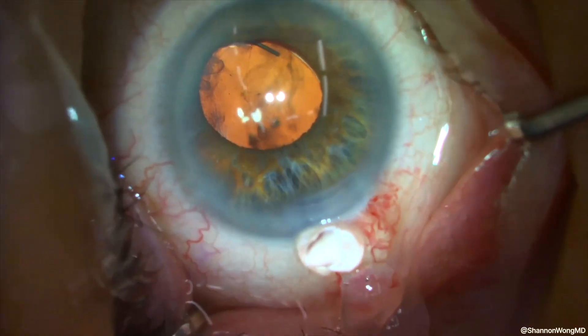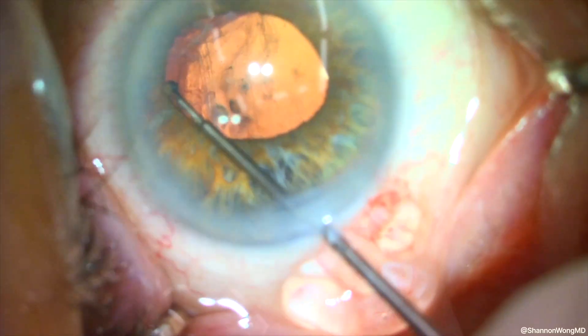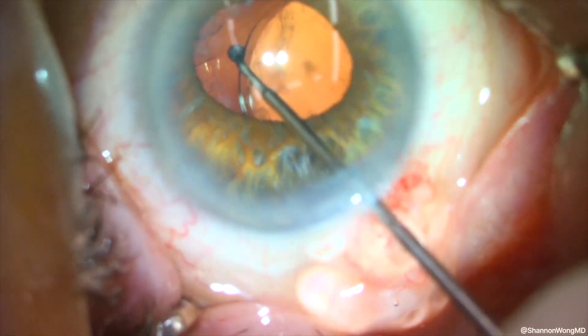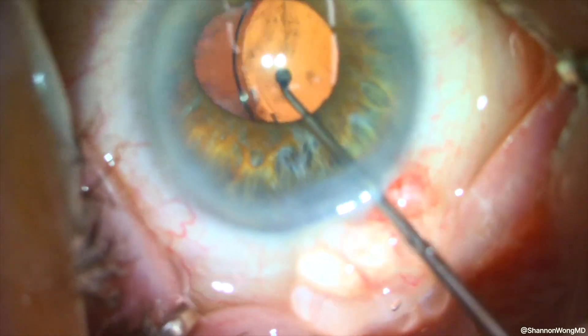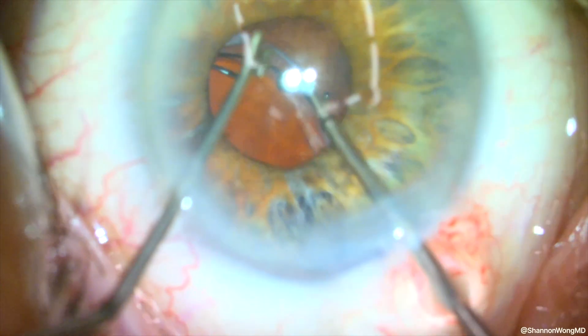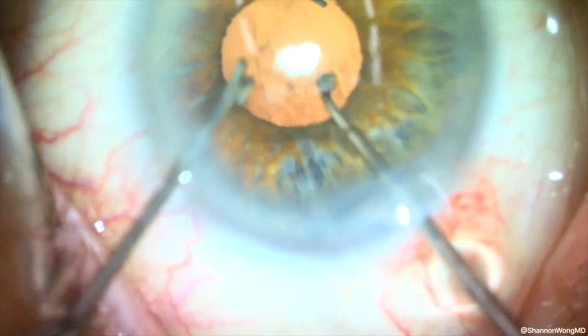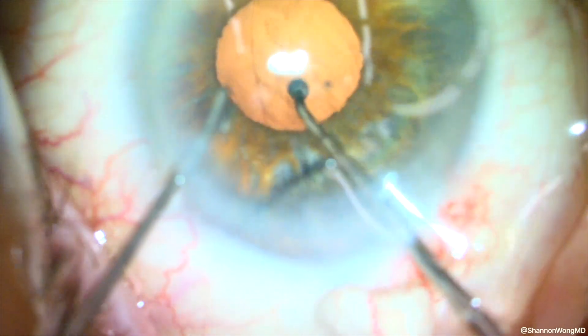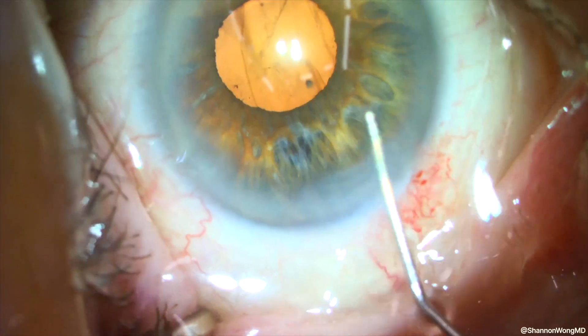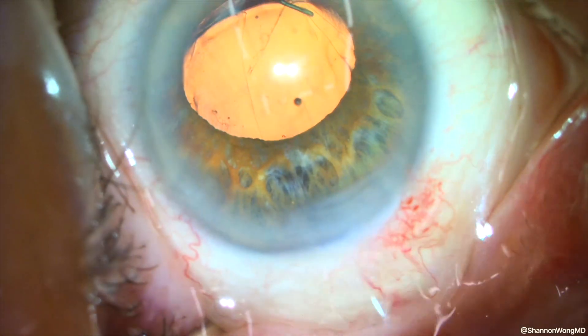What I notice is that the optic is not centered. We gently maneuver the left half of the lens optic posterior to the anterior capsular leaflet, then move the right half of the optic completely behind the anterior capsule for optic capture. We then viscodilate the pupil to inspect the position of the lens, and it appears slightly decentered.